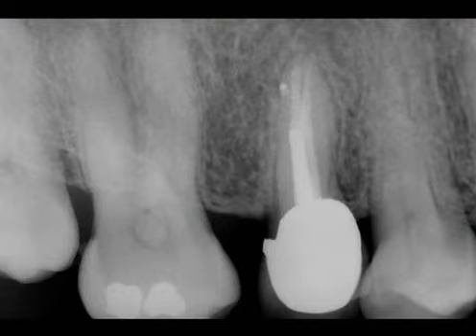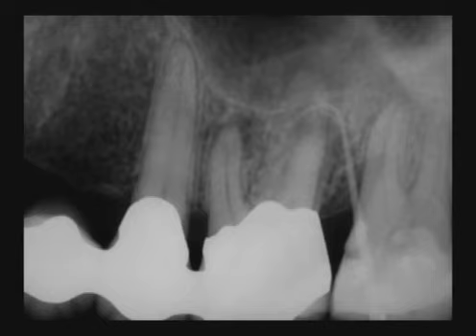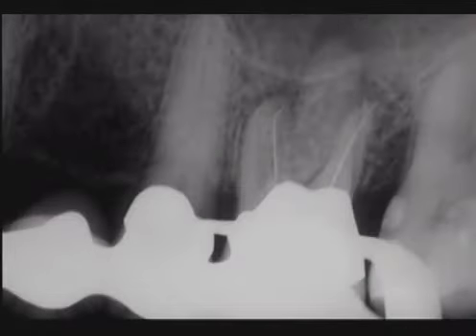Here is a preoperative film of a maxillary first molar posterior bridge abutment. Notice a gutta percha point tracing the sinus tract. Earlier in the show, we actually accessed this particular abutment, and I showed you the MB root. I mentioned that it was very interesting. Let's take a look. In this straight-on view, you can see that we've pre-flared the MB canal, and now a pre-enlarged canal can accommodate a pre-curved file to length. Notice the 10 file in the distal buccal to length.